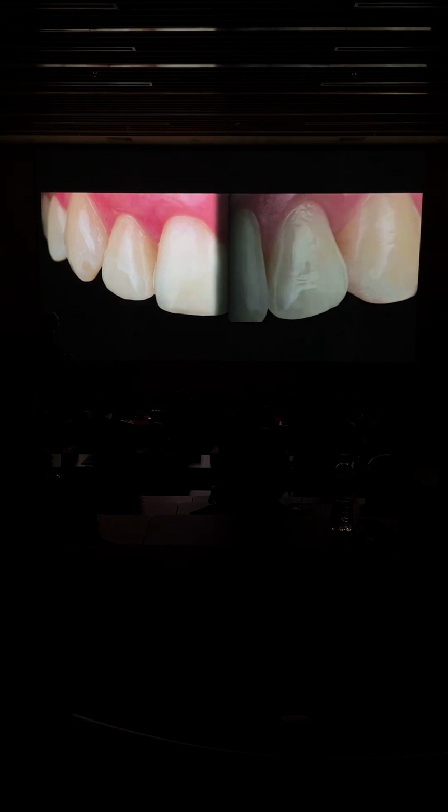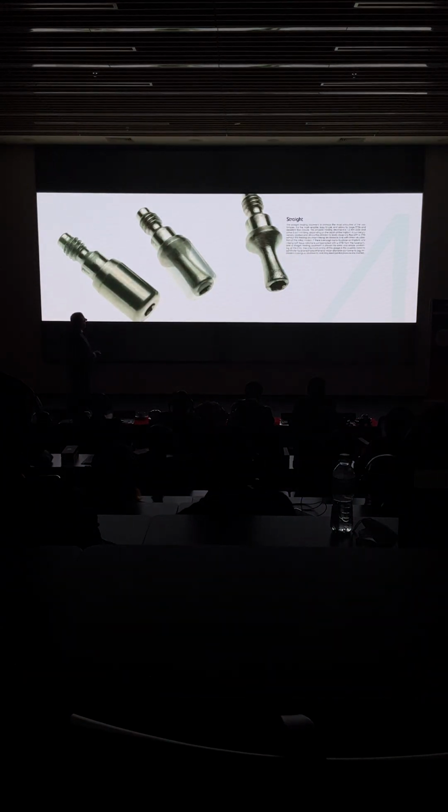We wanted to have a perfect adaptation of your flaps, so we could see no incision whatsoever. This is the result several years after, where you can see that the papilla height is pretty much level with the rest of the papillas. But this guy was just amazing.